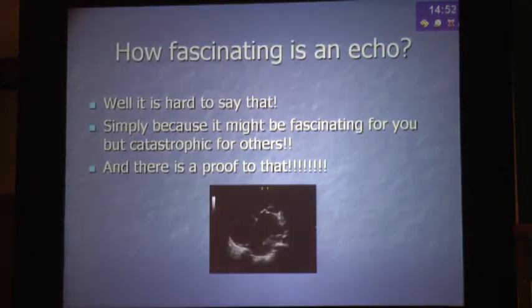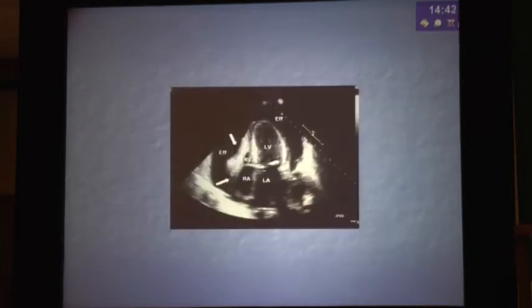Well, how fascinating is an echo? I'm sure everybody wants to learn echo, but like I said, if you need to practice echo, you need to be very good at it, because you can very easily misdiagnose if you're not well trained. This is a very common thing which is missed and can be catastrophic.